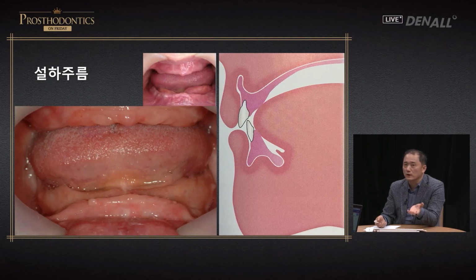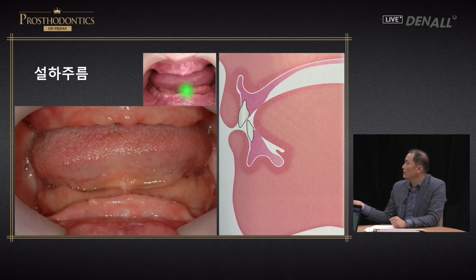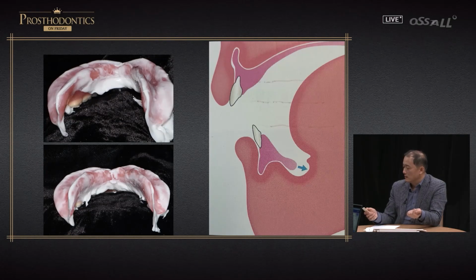Then even with the retraction of the tongue like this, the lingual fold is there to create sealing. So the retention and the closeness is something you need to check. So you have to see where the lingual fold situation is, and if you leverage that, it's better to maintain retention. So here, it should not be excessively pushing, but regular and consistent, not focused on some position. So having that consistency or the same level is very important.